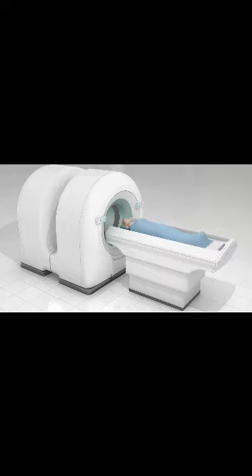In general, PET scans may be used to evaluate organs and/or tissues for the presence of disease or other conditions. PET may also be used to evaluate the function of organs, such as the heart or brain. The most common use of PET is in the detection of cancer and the evaluation of cancer treatment.